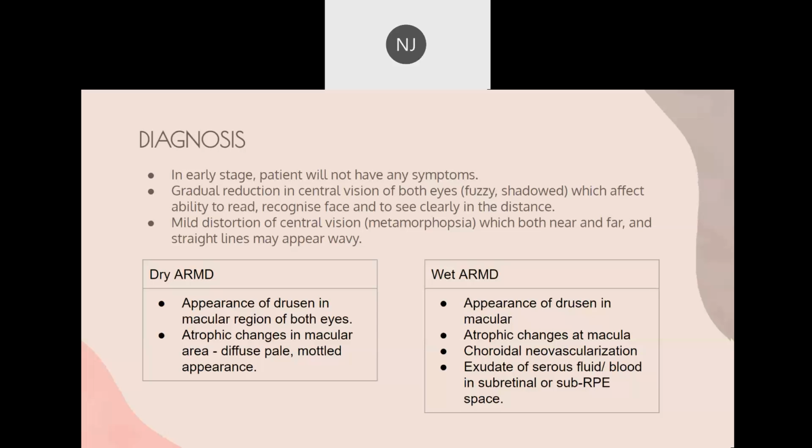Hazira, how do you monitor metamorphopsia? Do you know how to identify metamorphopsia? Is it using the grid test, doctor? Amsler chart? Have you seen an Amsler chart before?